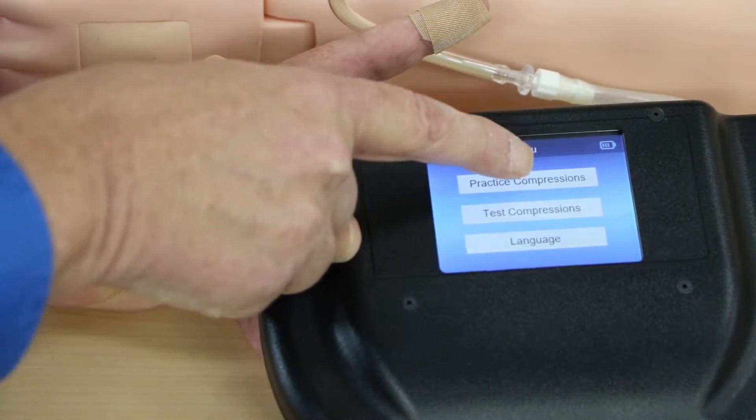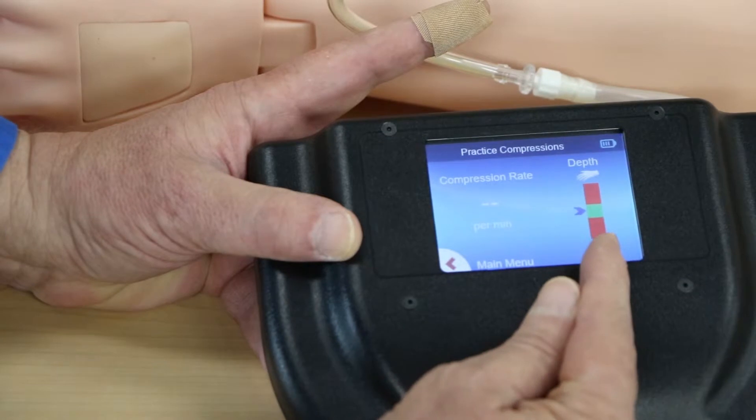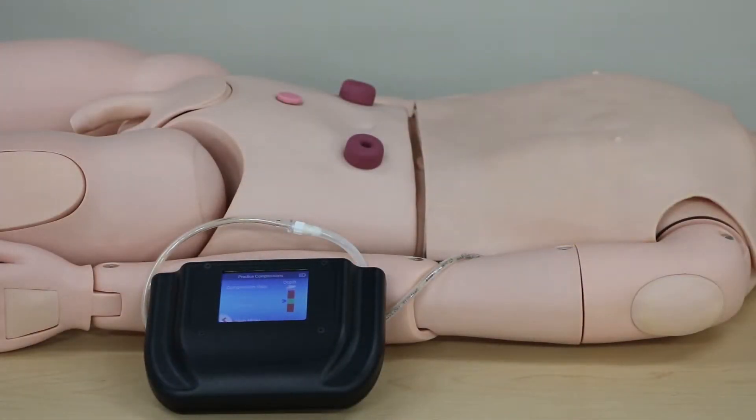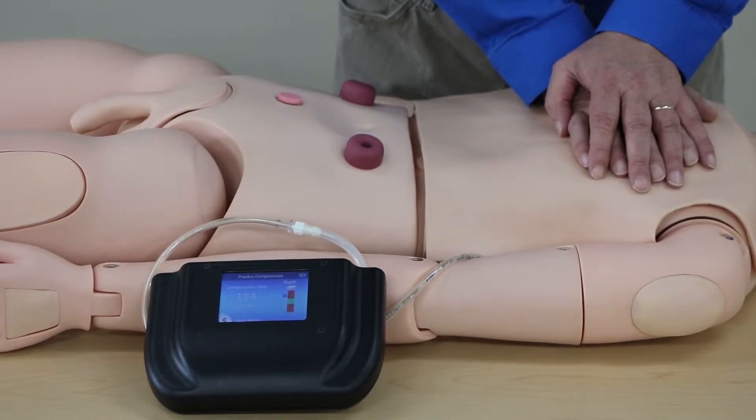Now we're going to go into practice compressions. It's going to show our compression rate and our depth. The metronome tick is going to give me the suggested rate, so I'm going to try to mimic my compressions with that tone.